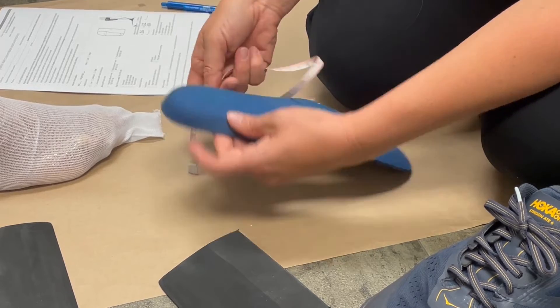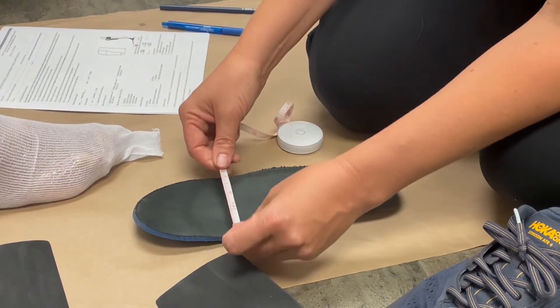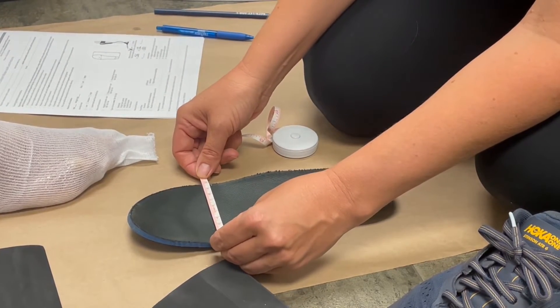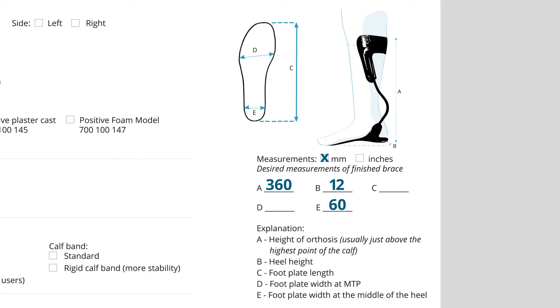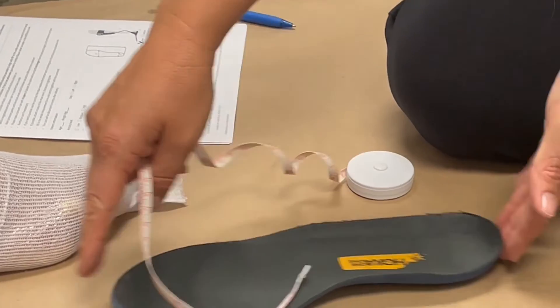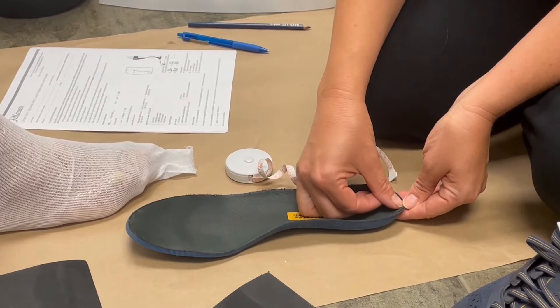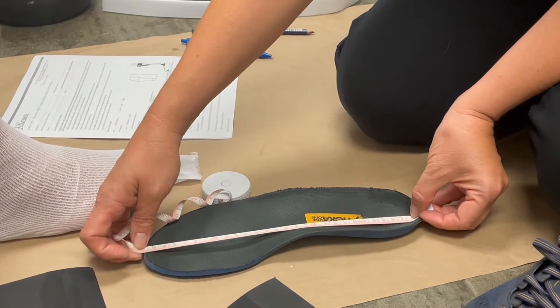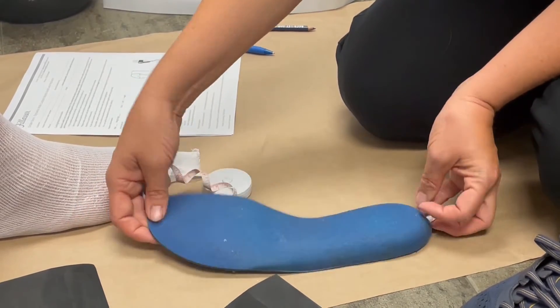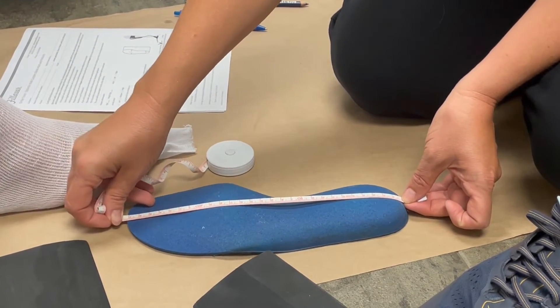The heel measurement is 60 millimeters. We also need a measurement over the MTP on the insole — that's 9.5 centimeters, which is the D measurement. Then the C measurement is the length of the insole, measured from the front. This one is 27 centimeters, or 270 millimeters.